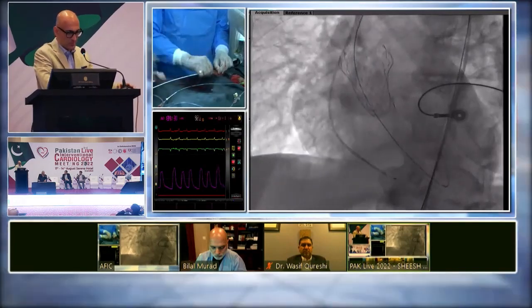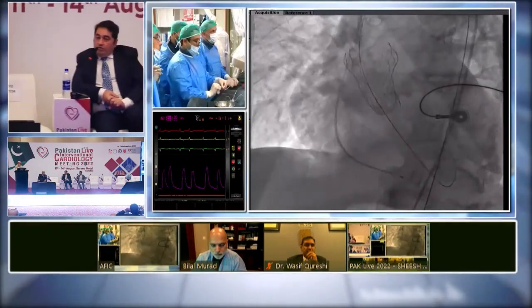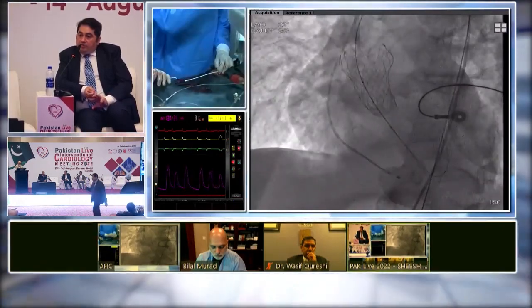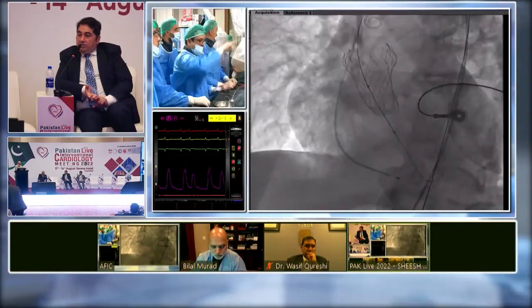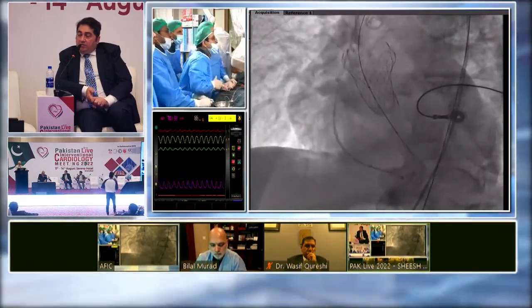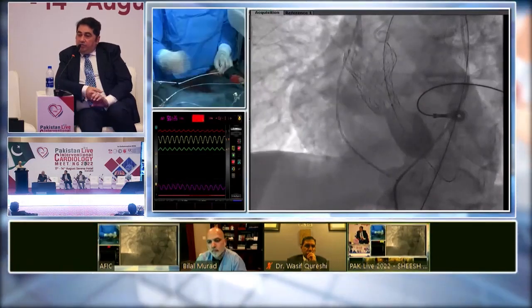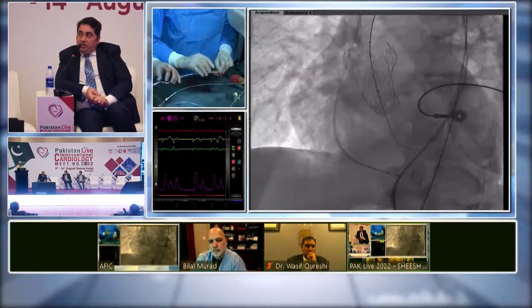For a self-expandable valve, when I see the calcium, I think about whether I will have to post-dilate this valve or not. If I have to post-dilate, I don't aim too high at times. Pre-dilatation is important. As mentioned, it's a bicuspid, so in bicuspids I routinely pre-dilate always. In tricuspids, I don't routinely pre-dilate in calcified patients. The preparation of the CT scan is very important, so I analyze all my CT scans myself to plan all of this.